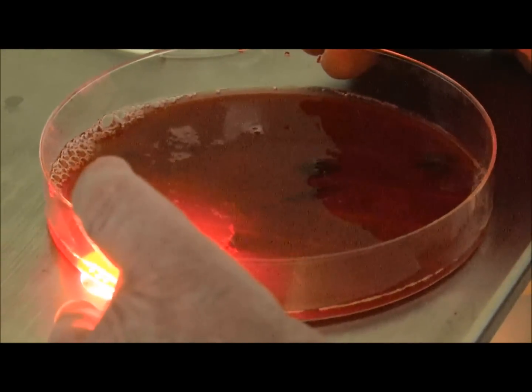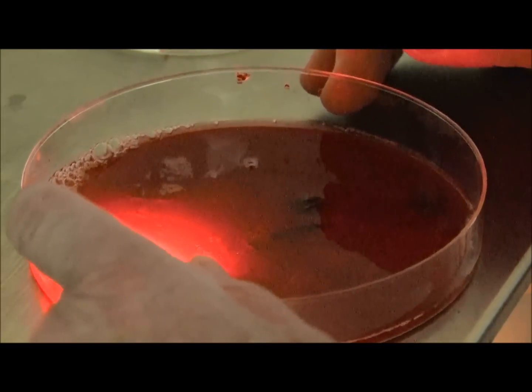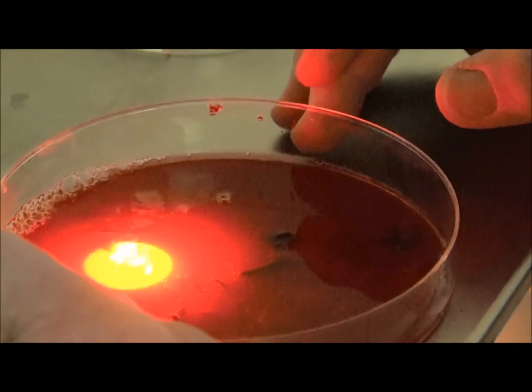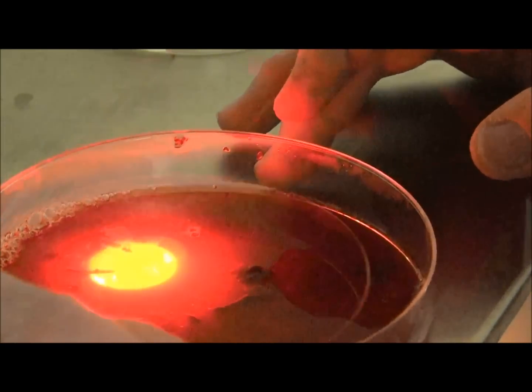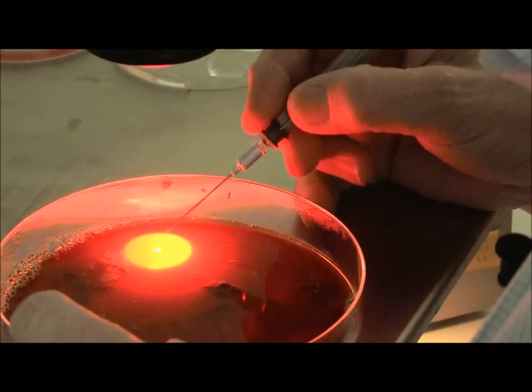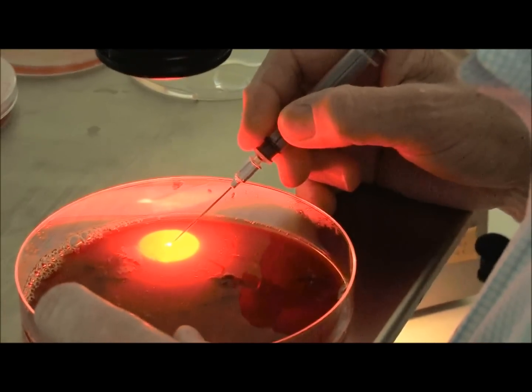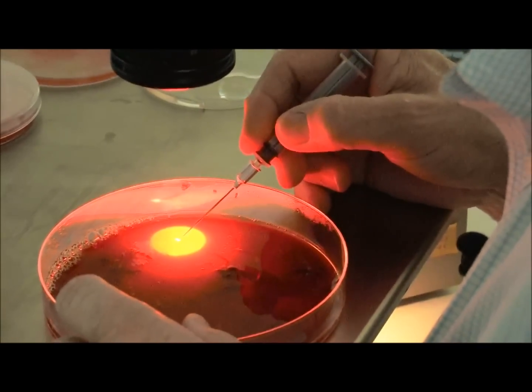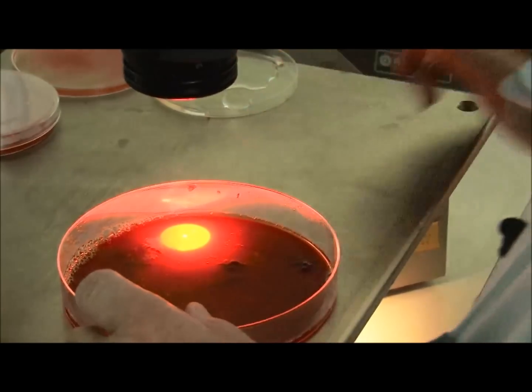There's one oocyte in each follicle. Sometimes we get 80 or 90% of them, sometimes we get 20 or 30% of them, depending on how successful the aspiration procedure was.